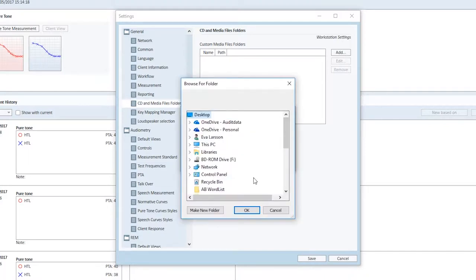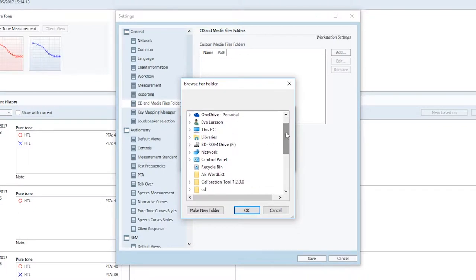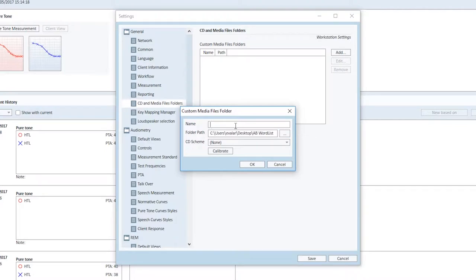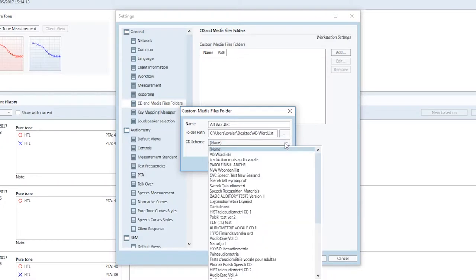As an example, we install the AB wordlist from the PC by locating the wordlist from the PC. Name the media file in Primus and choose the correct protocol or scheme to ensure that the words from the list are displayed on Primus speech audiometry screen.